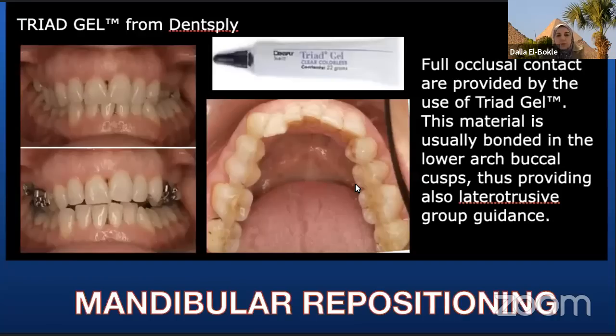I just need to make a quick remark on the mandibular repositioning technique. I think that this technique should only be used by those who are good in dealing with TMJ problems and those who can read the CBCT of the patient or document it before they start treatment and look at the condylar position, and be very wary of the condyles during such a treatment. Just a note of caution.